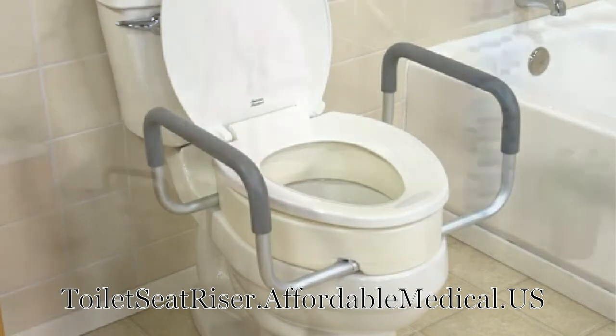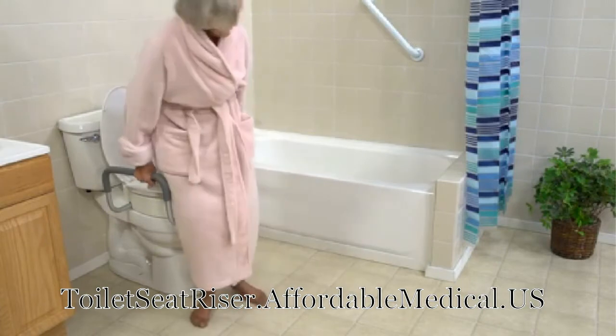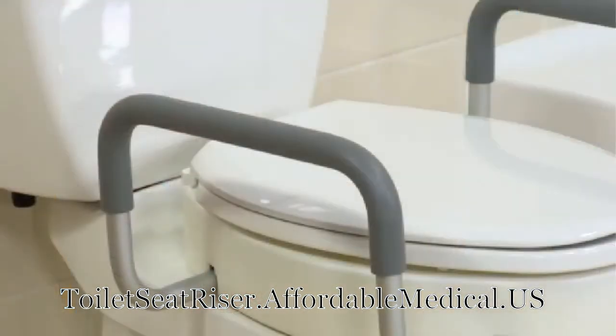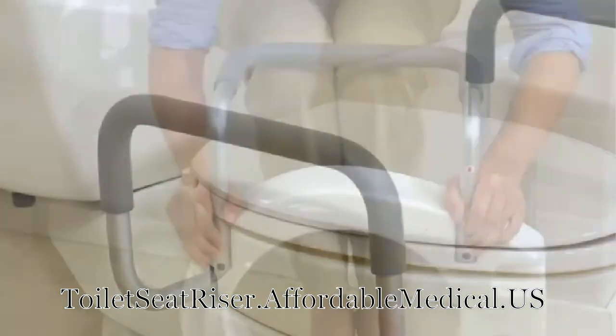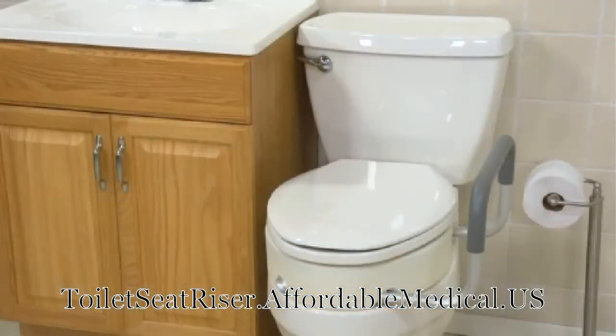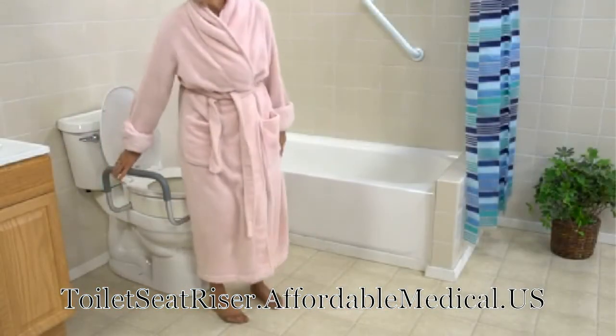These durable metal arms help the user safely support themselves when lowering or rising and provide additional security while seated. The arms are padded for comfort and can be removed or added as needed to accommodate transfers from wheelchairs, tight bathroom spaces, and storage.